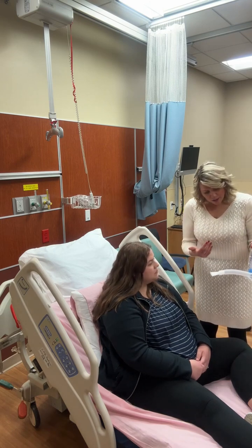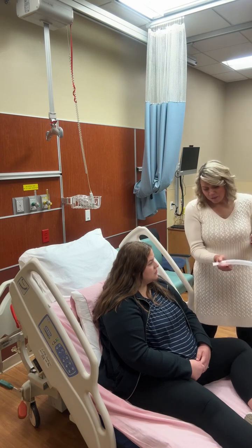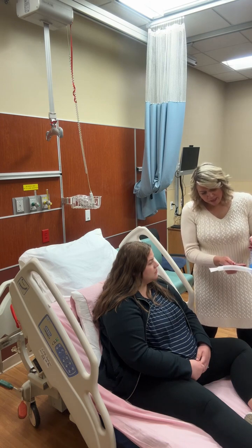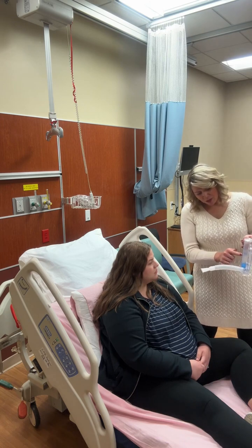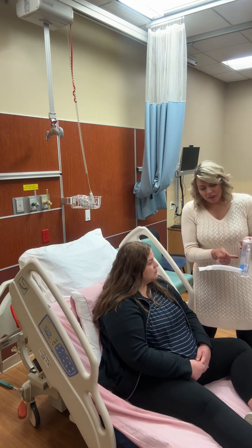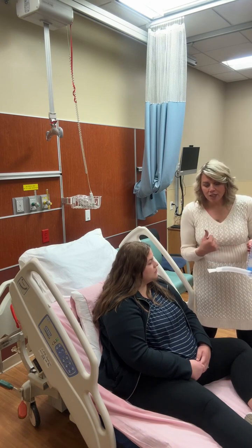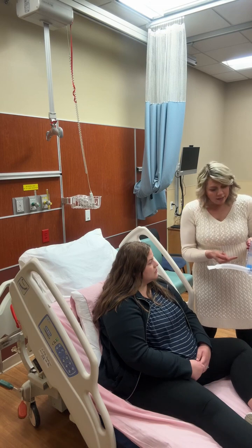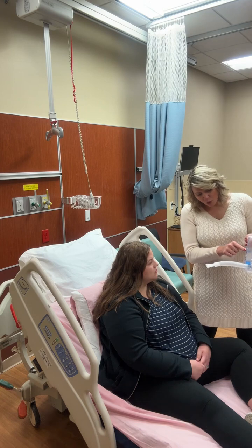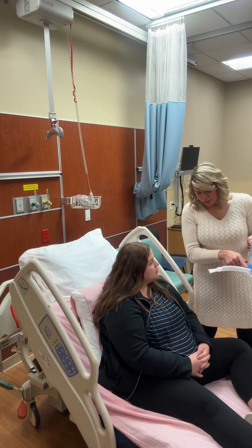It's a very simple task. It's not always the most comfortable thing, but it is an easy way to prevent the pneumonia from getting worse. Okay? So this is the handle. This is the tube. You're going to put this in your mouth. Make sure you have a nice seal around it. And the idea is we've put you on a certain number, which is usually set by the respiratory therapist or doctor. Typically, it's an equation that they figure out based on the patient's age, height, gender, stuff like that. And then it comes in a little pamphlet. It's on there. You can figure it out. So your goal is 1,250 cc's or milliliters is what we're measuring here.